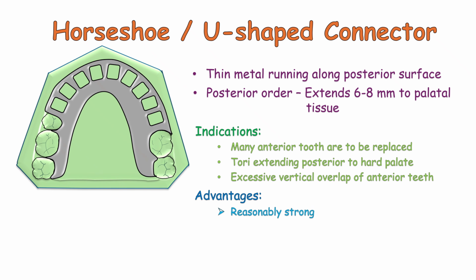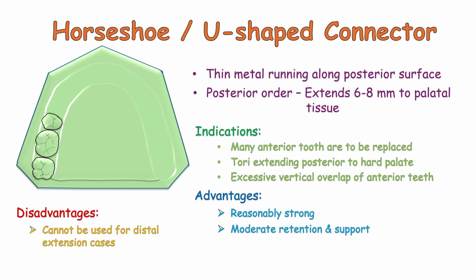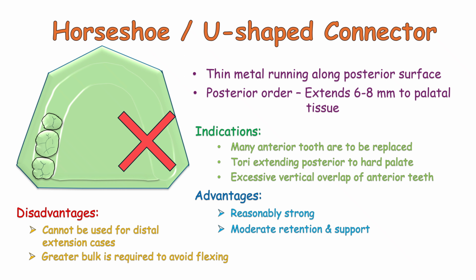Advantages: it is reasonably strong. It has moderate retention and support. Disadvantages: it cannot be used for distal extension cases, as when vertical forces are applied, it tends to straighten, and greater bulk is required to avoid flexing. This may cause discomfort to the patient.